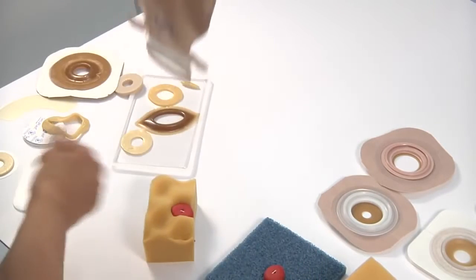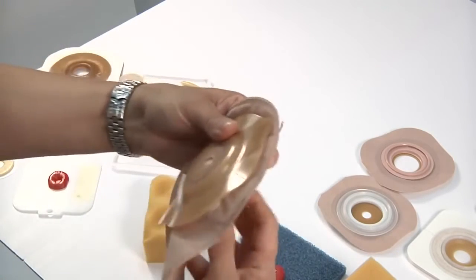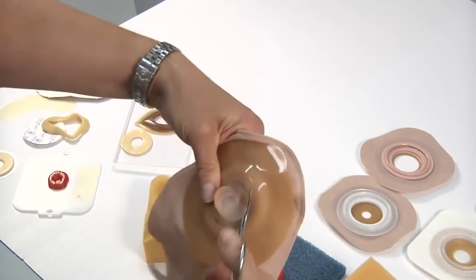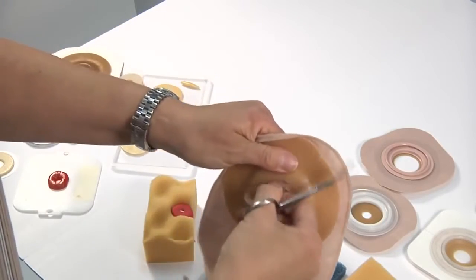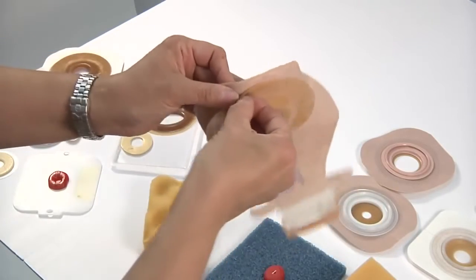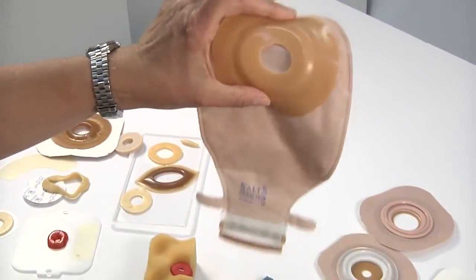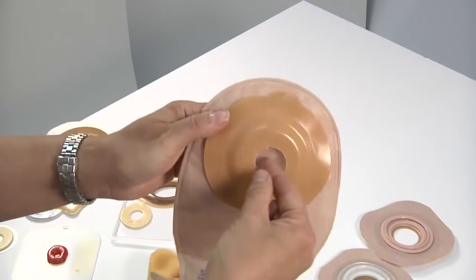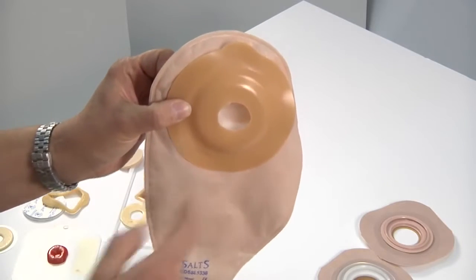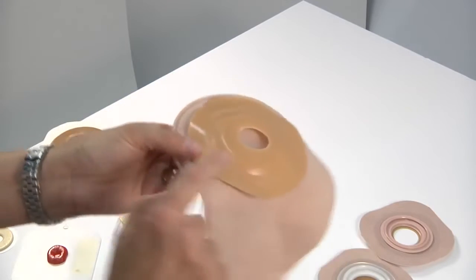With this particular one, once you've actually cut it, so we'll just cut an opening in here, once you've cut your opening, and once you take the release liner off, you can actually appreciate even more just how soft that is. That's very, very flexible. But you can also see that this doesn't actually have a lot of rigidity. So if you need a lot of tension right where the stoma is, this is not going to be the product for you, because any degree of rigidity is actually way out at the periphery here.